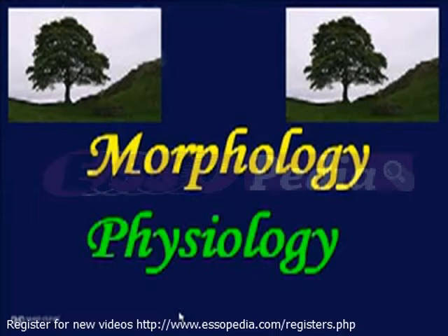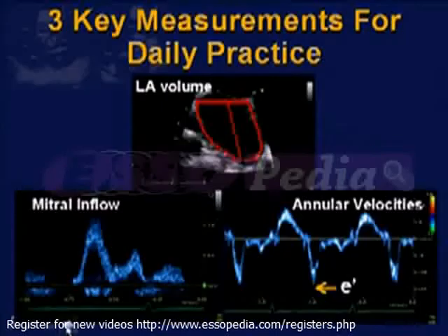So we remind ourselves that echocardiography really stands alone beyond all other non-invasive imaging modalities for its unique ability to give us insights into cardiac morphology as well as into cardiac physiology. And when trying to evaluate for left ventricular diastolic function, or more specifically, the physiologic consequences of abnormal diastolic function, the elevation in LV filling pressure, although there are other echocardiographic parameters that may be used, it is these three which represent those which are commonly used in daily practice to unlock many of the mysteries.